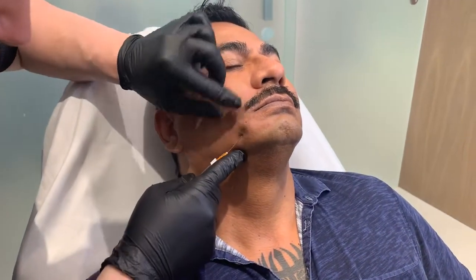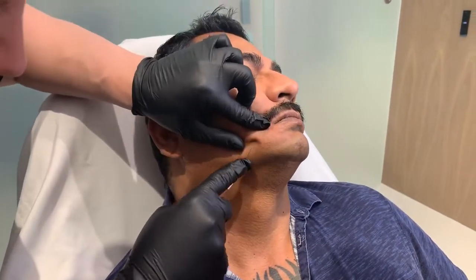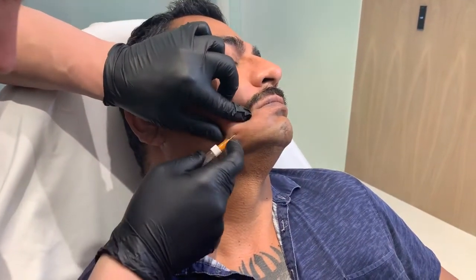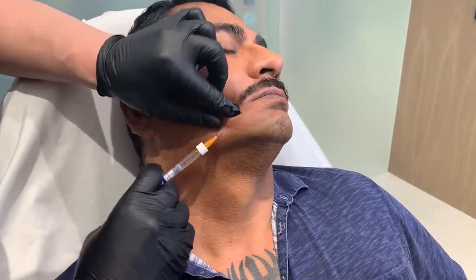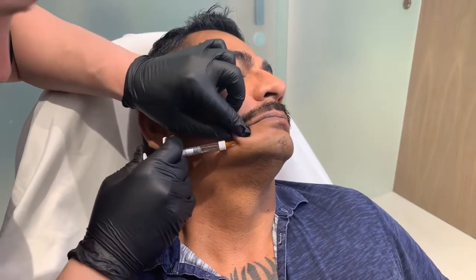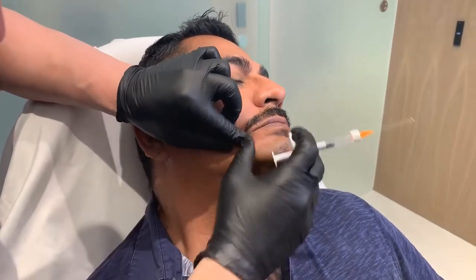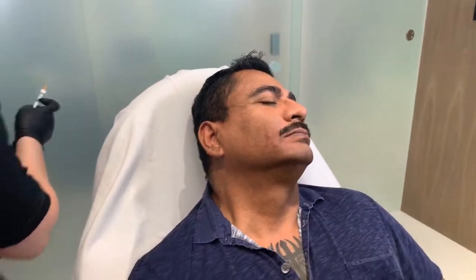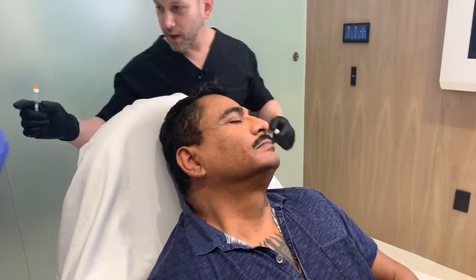Look to the left for me. Left. Perfect. We're going to use the cannula here. Men have hair follicles, so it's a little harder to push through the tissue. Don't freak out, you guys. Perfect, okay. So I'm going to do a light massage there, and I want to go to the other side. You can do a little Q-tip on that side for me.